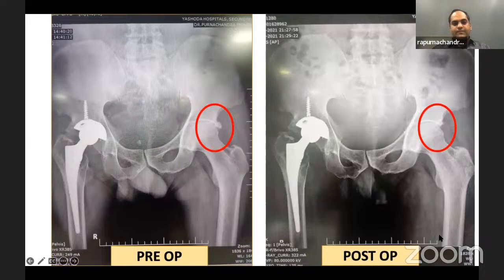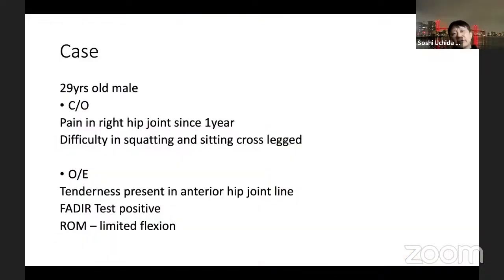He is very happy. He is now 52, and you saw that the cartilage was not that bad. It was maybe grade 2 chondral changes. So I would think that this patient may go on for 5 to 8 years before he decides to go or decides not to go for a hip replacement. Okay. Great.